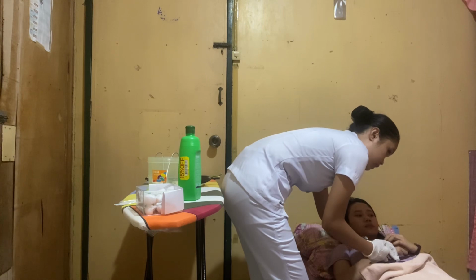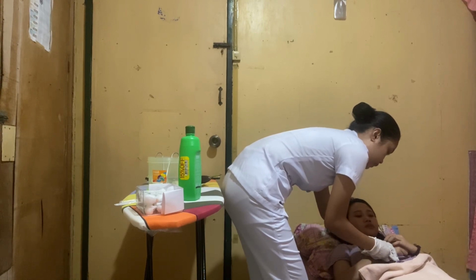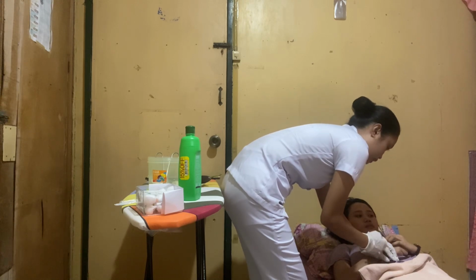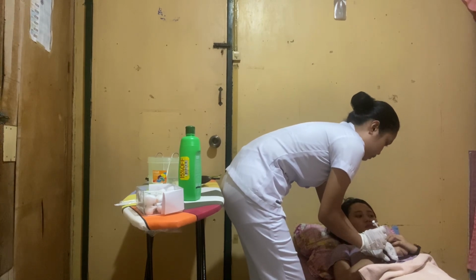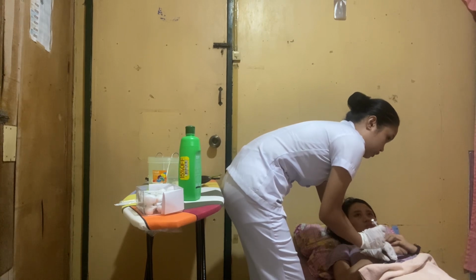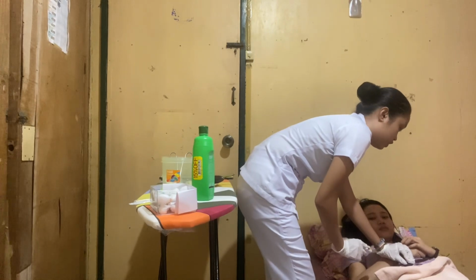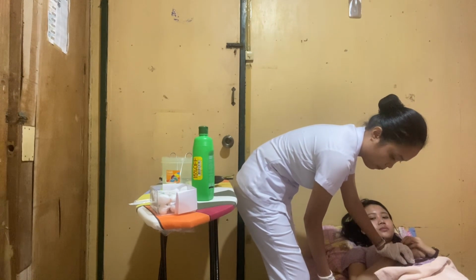Now release the pinched skin and then support the syringe, then push the medication. And after doing that, I'm going to remove the needle at the same angle as it was inserted. And if bleeding occurs, apply pressure to the site with dry sterile gauze until it stops. Then dispose of the used syringe into our waste receptacle.